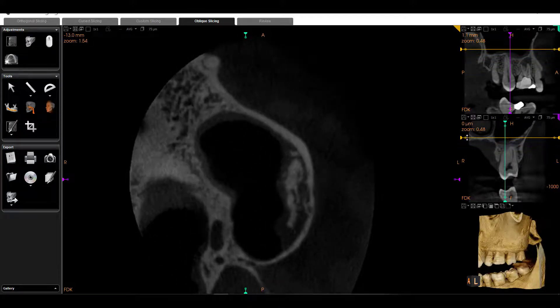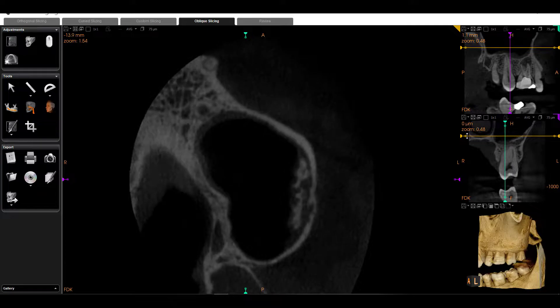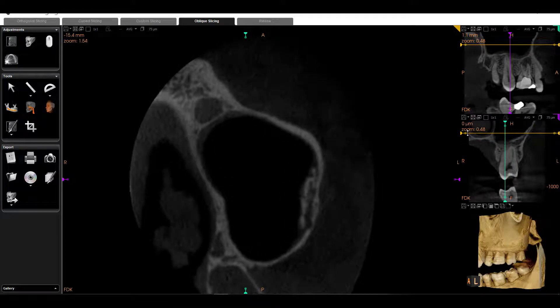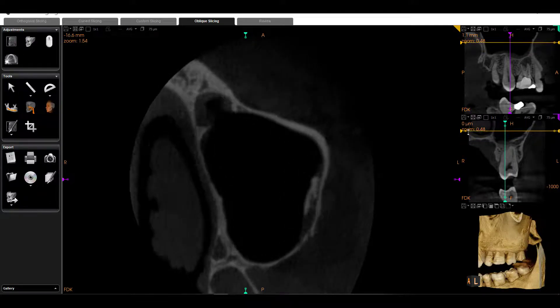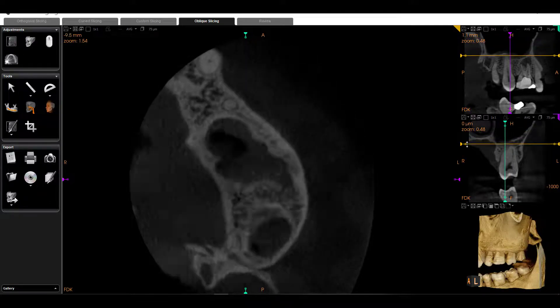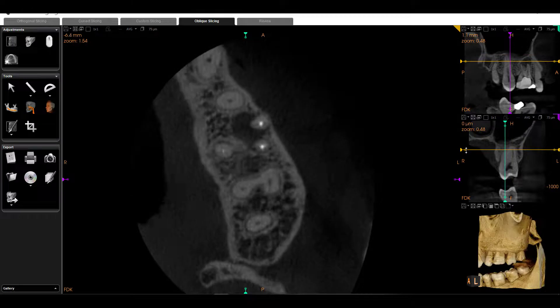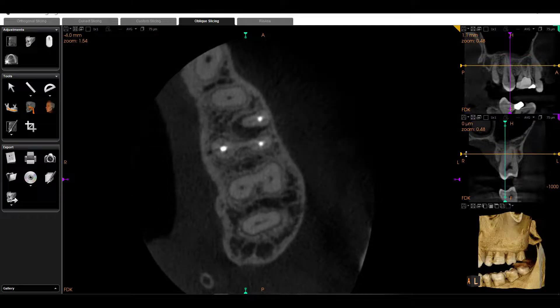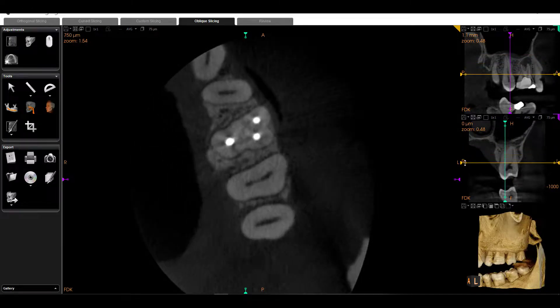We can see a calcification in the sinus — we're not going to be focusing on that today. I'm going to come back coronally for one more look.